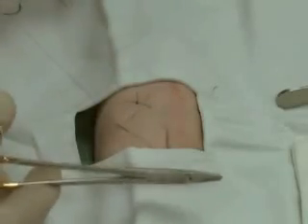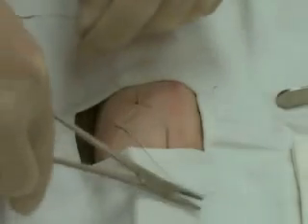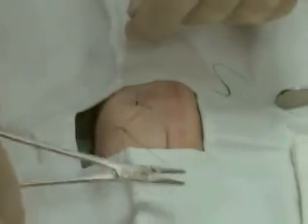Throw twice for a surgeon's knot. Cross your hand and the instrument to allow the knot to lie flat. Again, put the instrument in the middle and cross, and the knot again will be flat automatically as you cross your hand and the instrument. With a non-braided suture, 4 to 6 throws is adequate.